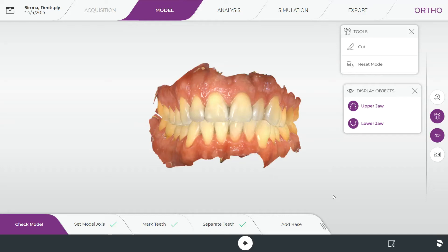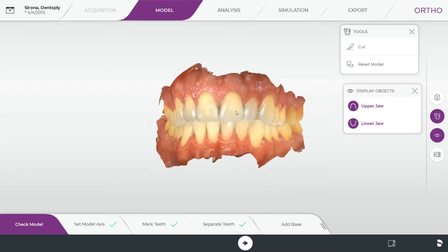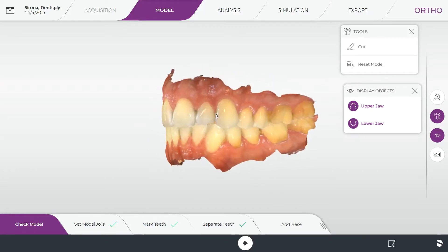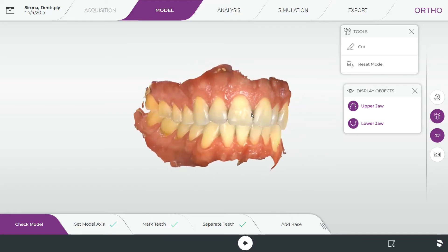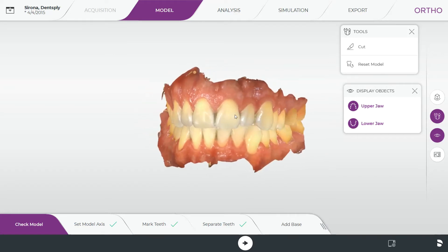Today we're going to take a look at the CEREC Ortho 2.0 software. I'm going to run you through the software, show you how to use it, and some of the functionality that I think you'll find very valuable.